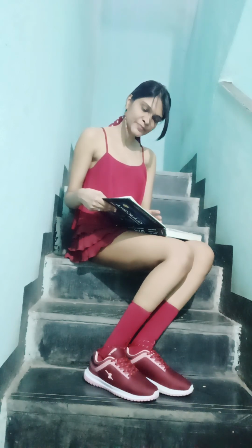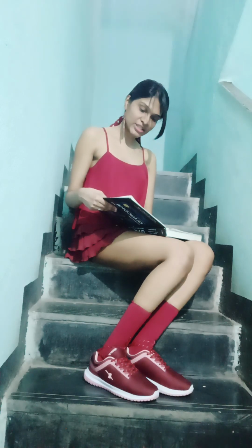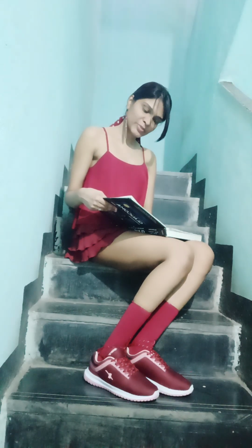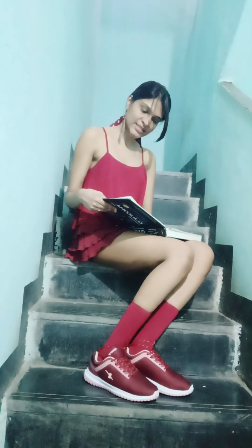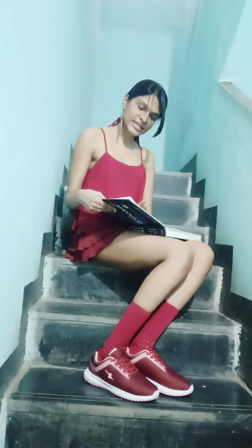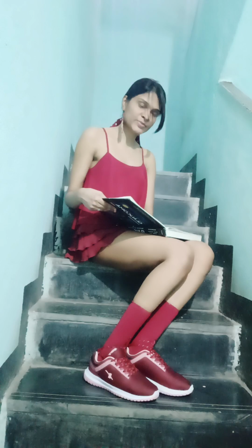Once again, the recorded data should include: A. Configuration of the angle. B. Depth of the angle on the basis of the most posterior structure that can be seen. C. Degree of pigmentation, and D. Presence of abnormal structures. For example, a normal angle might be recorded as wide open with visualization to a wide ciliary body band for 360 degrees and moderate trabecular meshwork pigmentation. Drawings can also be placed on a chart with concentric circles to document more specific details.